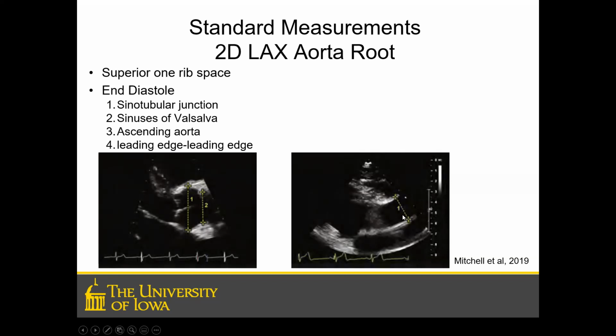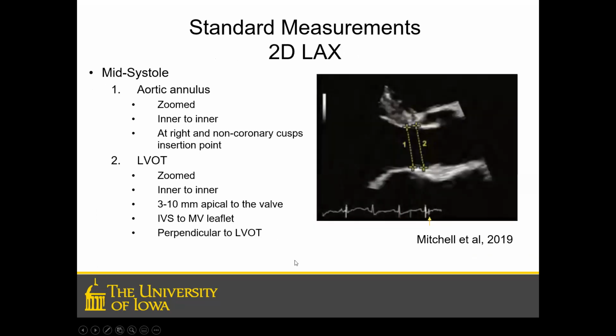And notice I did not say annulus. If you look at previous publications, we used to measure the annulus in diastole also, but now the annulus is measured in mid-systole, not in diastole. And this brings us to our mid-systolic measurements.